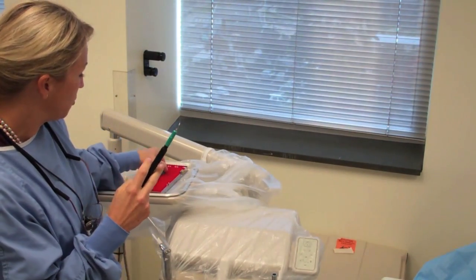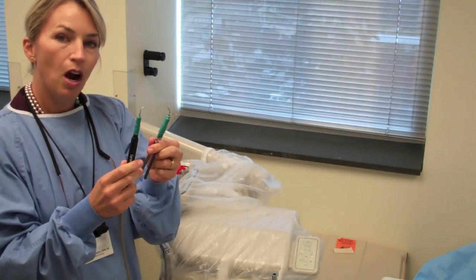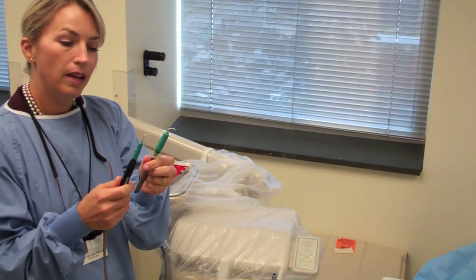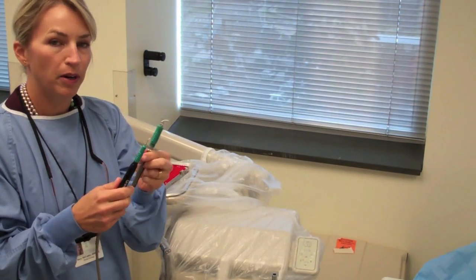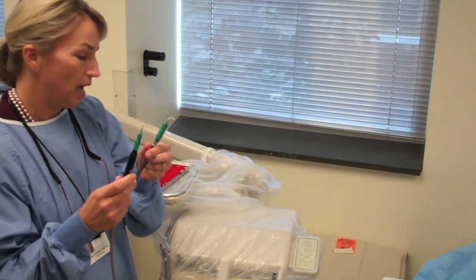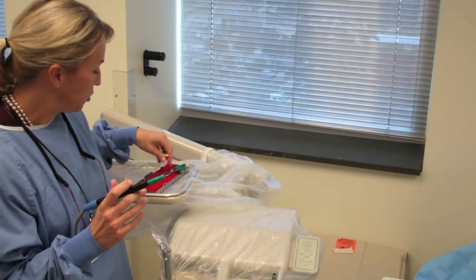One thing to make sure you understand is that tips like this, the Slimline tips, aren't tips that you're going to want to use for actual calculus removal in any patient that is periodontally involved. The calculus is far too tenacious, and this type of insert is not designed for calculus removal per se. It's really great for biofilm disruption.